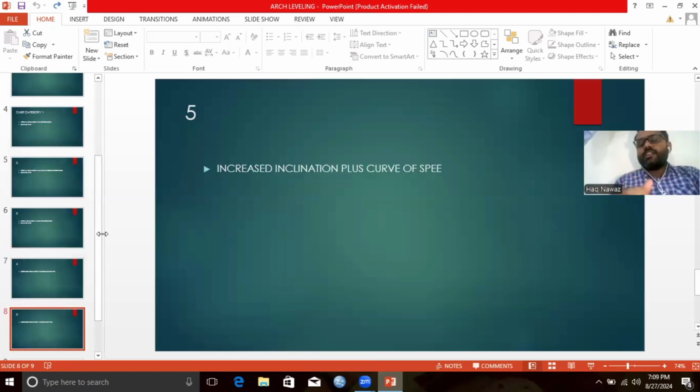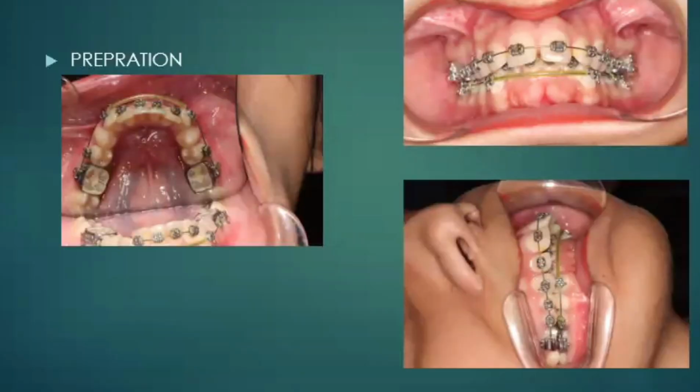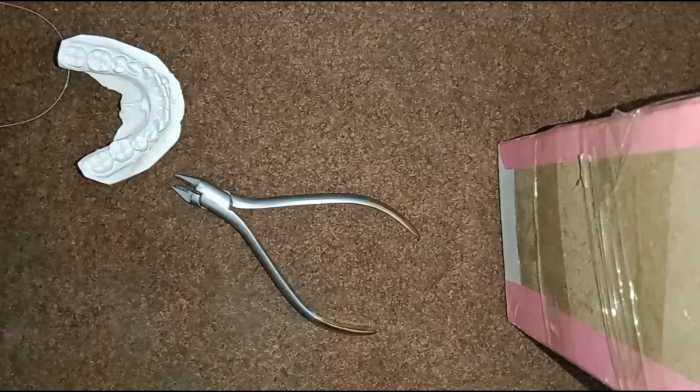Our patient is now ready for placement of the 3-piece intrusion arch. These kinds of patients are ideal for the 3-piece intrusion arch. The ultimate goal is to align our incisors in a separate segment and the right and left sides in separate segments. Now this patient is ready for the intrusion arch. Now we will have a practical demonstration of how to make an intrusion arch, and how to place and activate it. Now that is our patient ready for the intrusion arch.